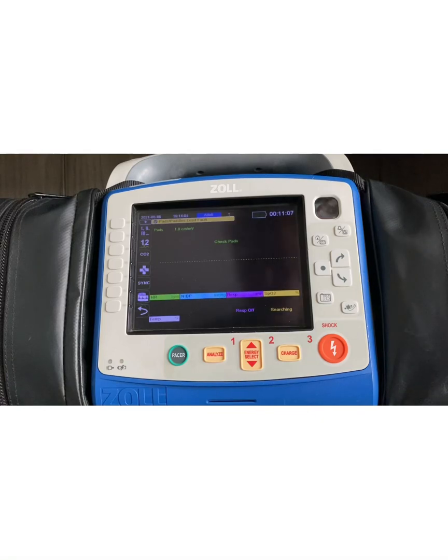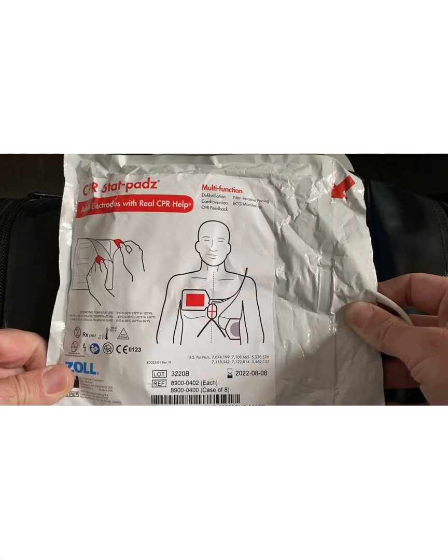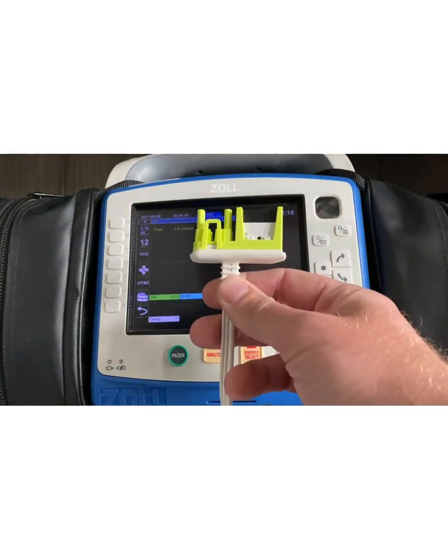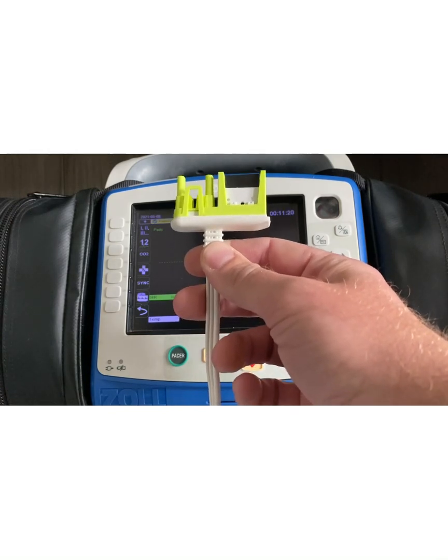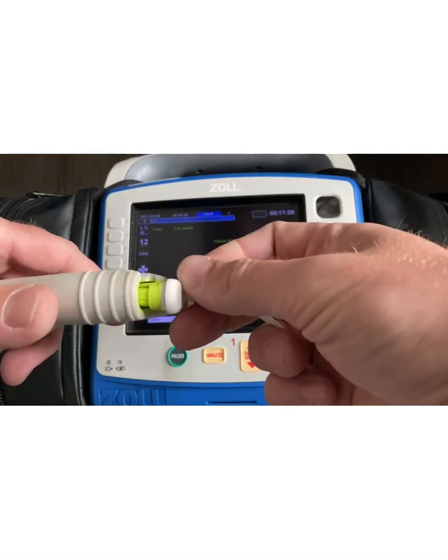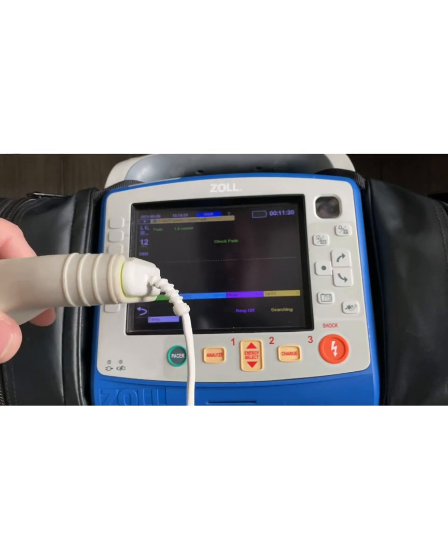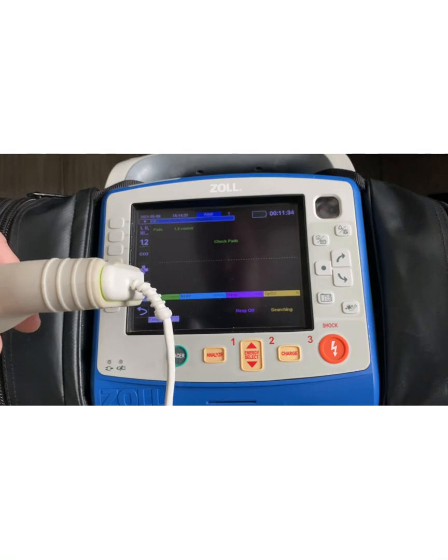In the pre-hospital world, the most common pad is the CPR stat pad. It has this connection, which is also consistent with any of our AEDs that you'd come across in the field. You plug directly into this adapter. Once the pads are applied to the patient and CPR is performed, you're going to get real-time CPR feedback automatically on the screen. So that's one option.